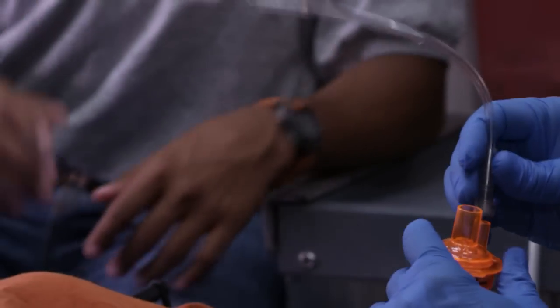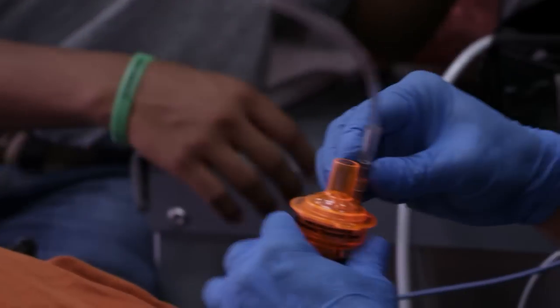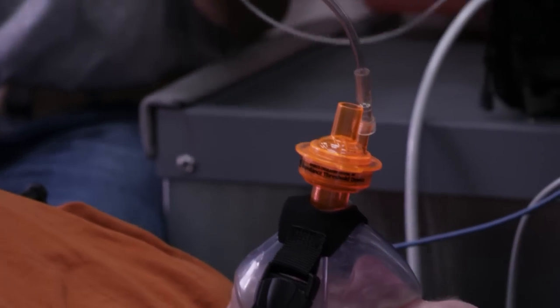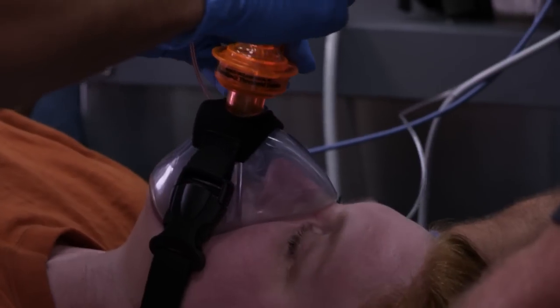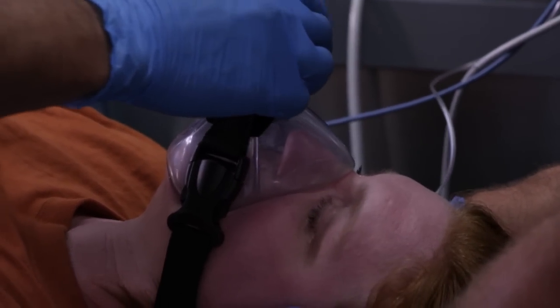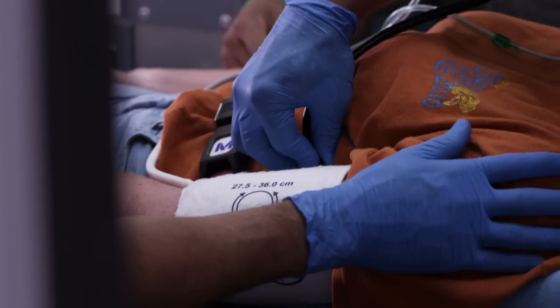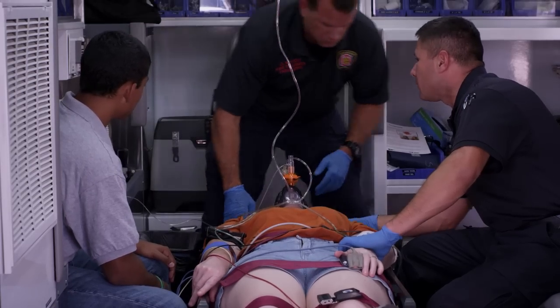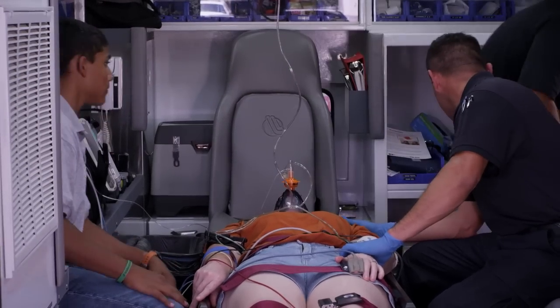Your blood pressure's dropping, okay? Take a couple deep breaths. Hopefully this will start bringing your blood pressure up. You'll start feeling better. Let's get another set of vitals, get another blood pressure going. O2 sats 96. 87 over 60. Okay, got a blood pressure of 87 over 60. The ResQGARD's working, but let's go ahead and get rolling.